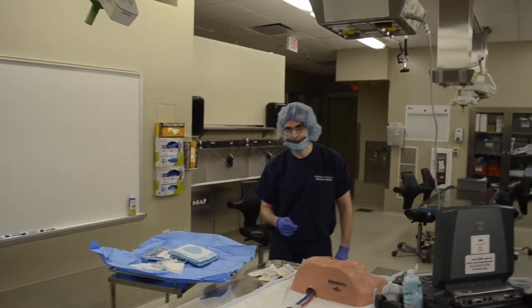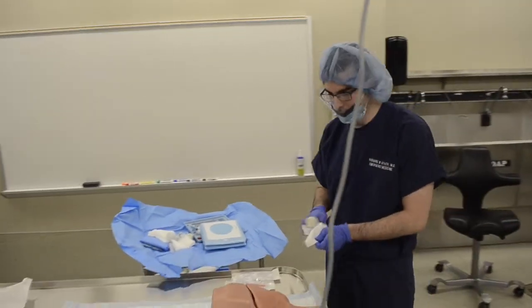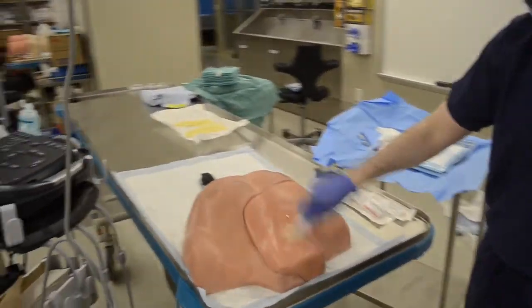All right, Richard, so what's a couple of first things that you do? So first we're going to clean the patient off. So I have those 3 chlorhexidines. These are cheap and I like to clean widely. So now we know about where we're going and I like to scrub it all.